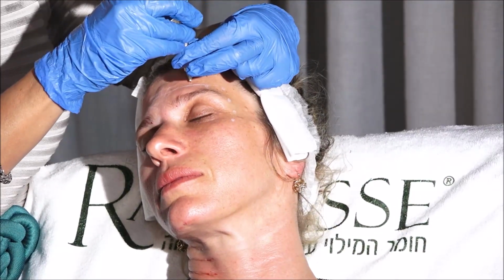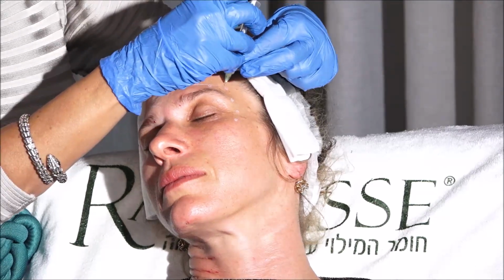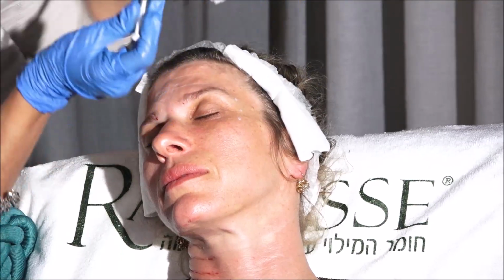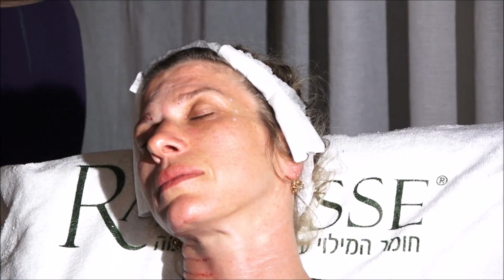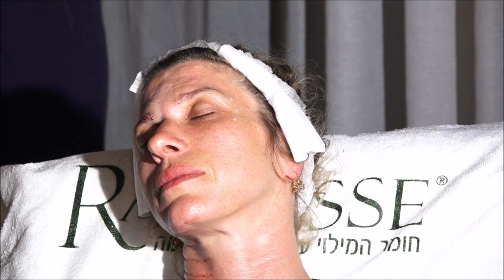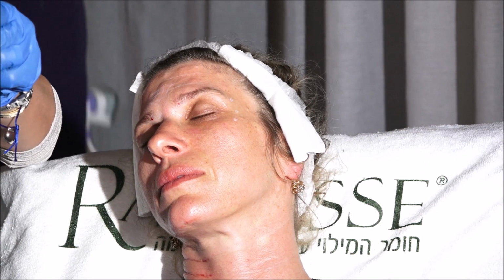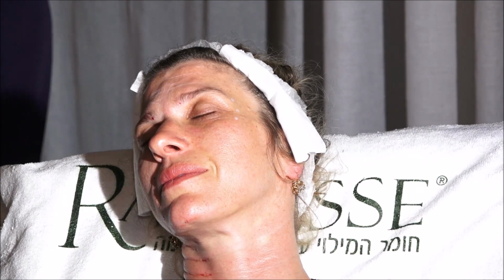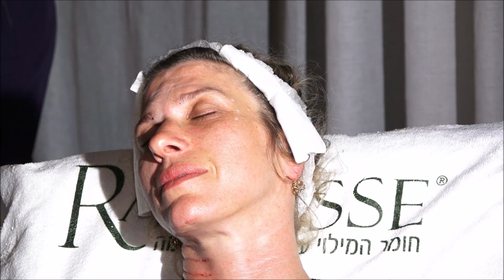I'm going to do the last points here. 1 unit, 1 unit. And then there's a little bit more left by the double dilution. Perfect. No, there's nothing here. Oh, okay.